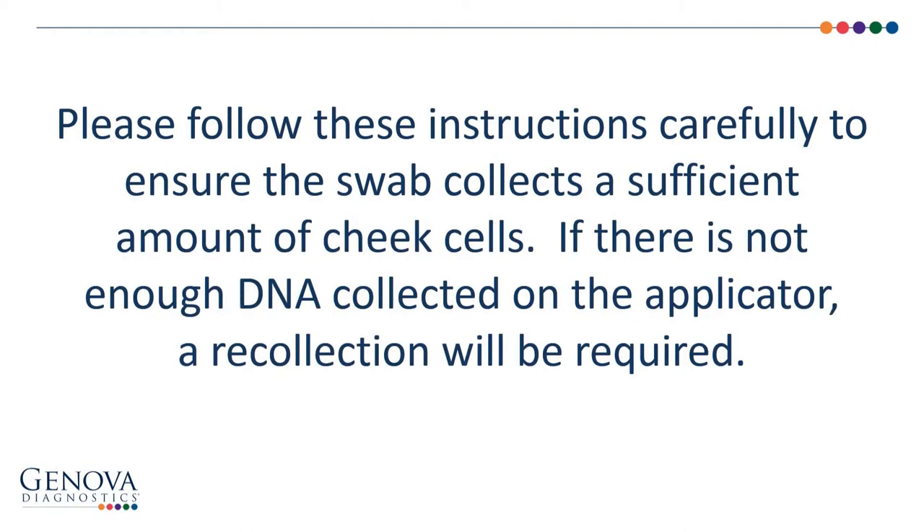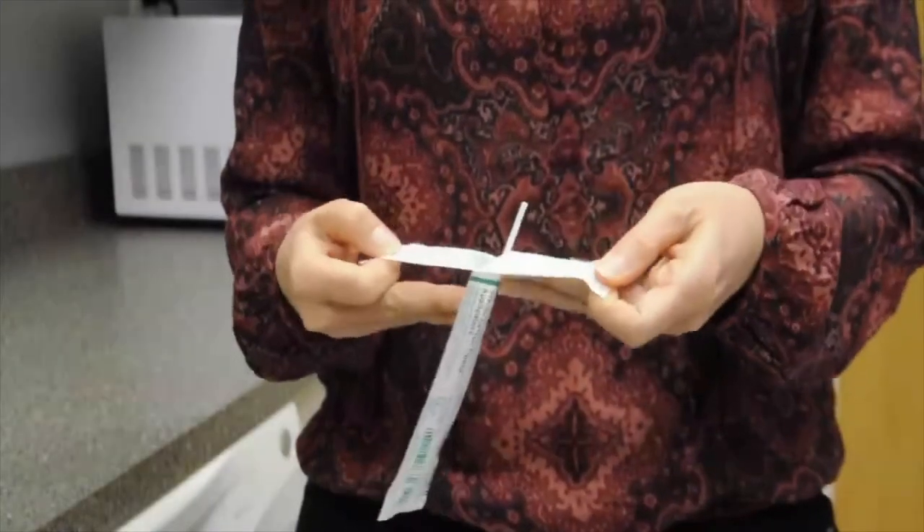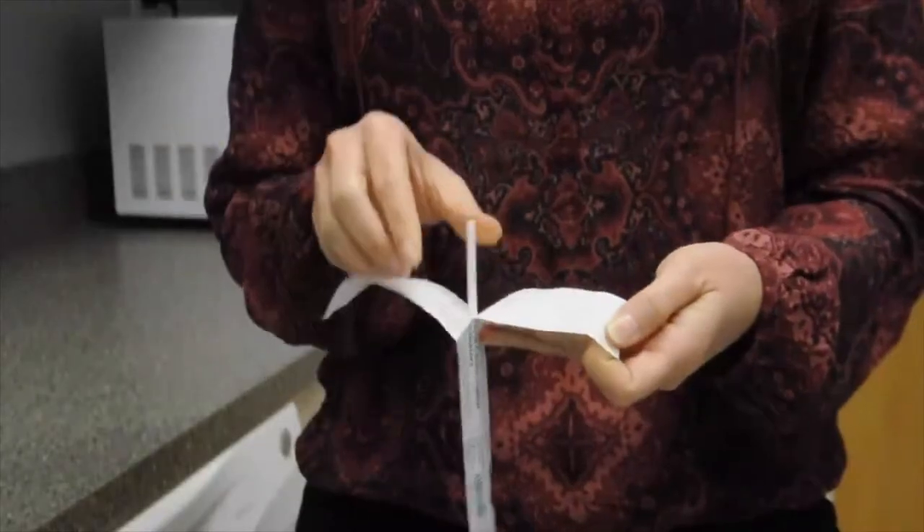Please follow these instructions carefully to ensure the swab collects a sufficient amount of cheek cells. If there is not enough DNA collected on the applicator, a recollection will be required. Begin by slightly peeling open the package labeled 'sterile cotton tipped applicator.'